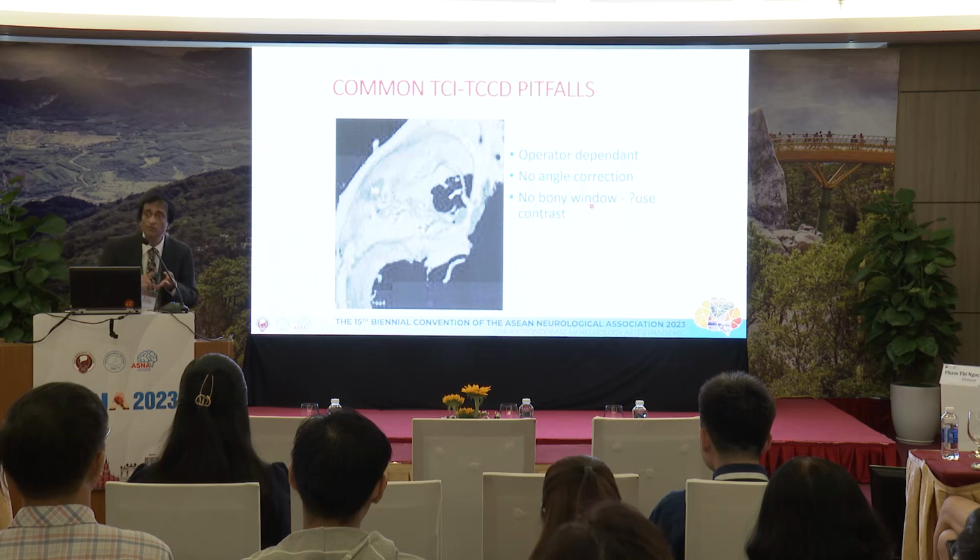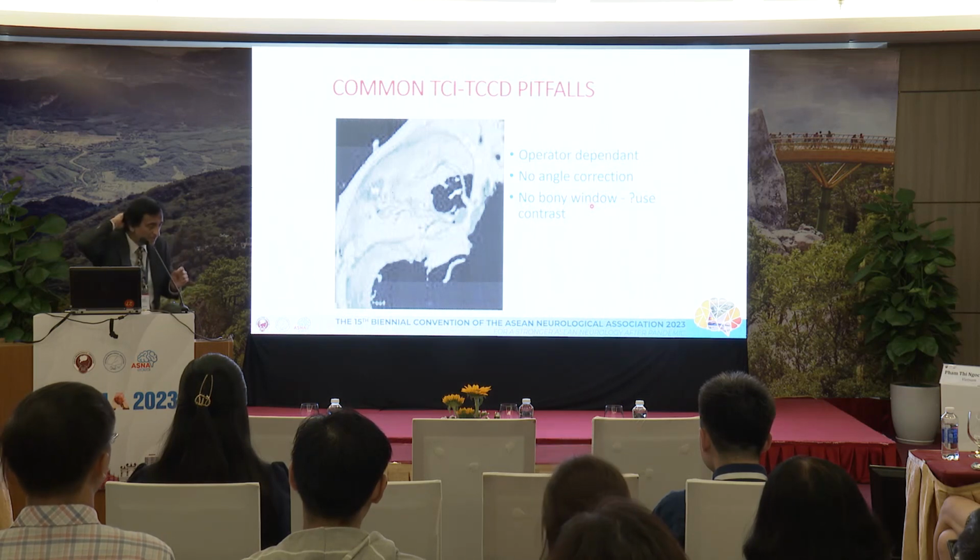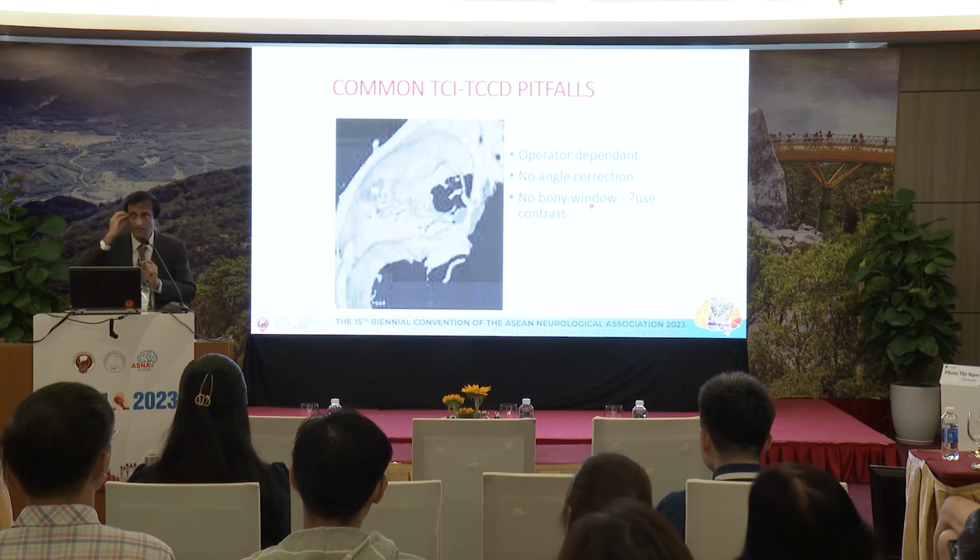Elderly, Asian women, we know, hard to find a window. Not impossible, but can be impossible. It must look very hard to find in these people. But this window, you'll always find. This temporal is difficult. So don't be discouraged.